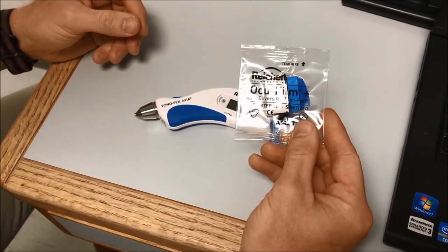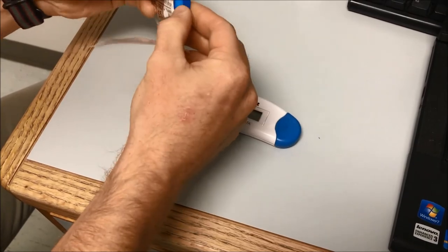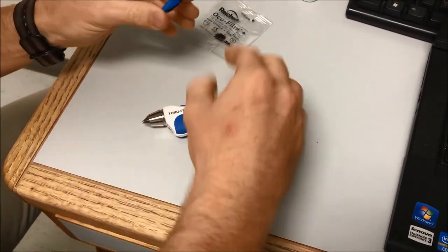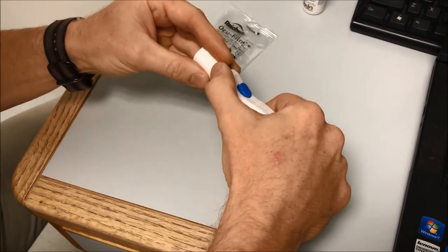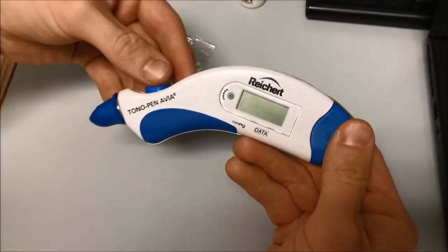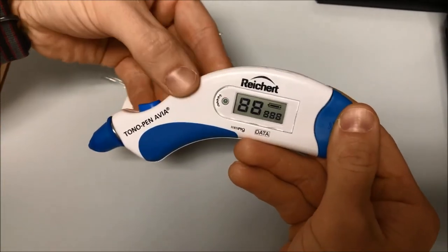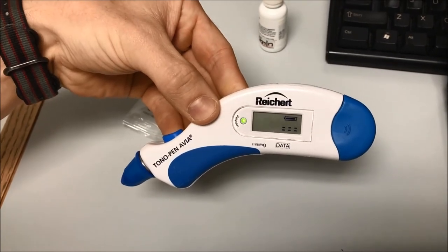We'll take one of these films — we're going to use one each time to keep it sterile. Then we'll turn on the device by pressing it once. Now it's ready to go.